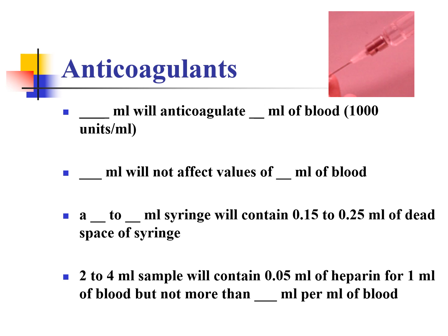So if you're only able to draw half of a mL, so 0.5 cc's of blood, that means you have a high heparin to blood volume, which means that can throw off your blood gas. That's what we're ultimately getting at here: did I get enough blood in this sample for it to be an accurate test to go run, right? That's the whole thing here. You do need to memorize these or get these down for this next exam, but that's what we're looking at here.